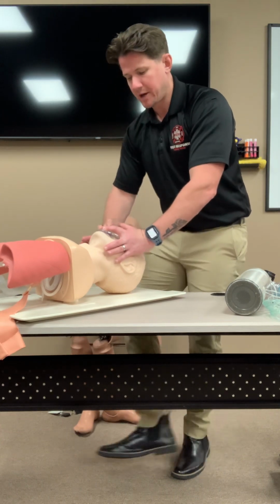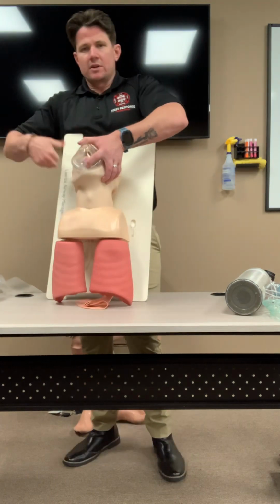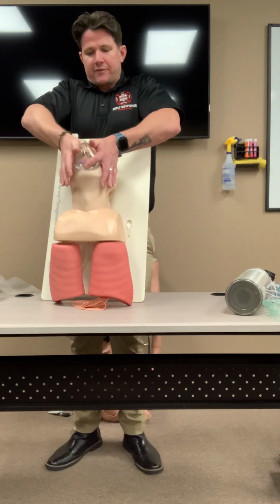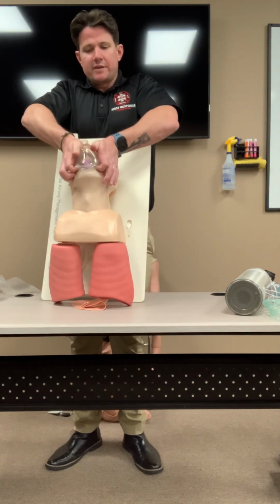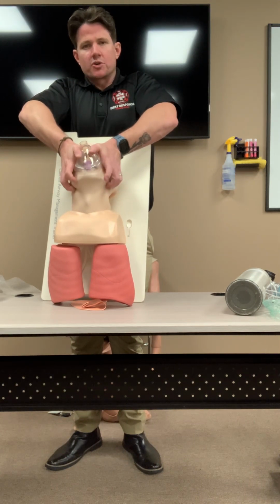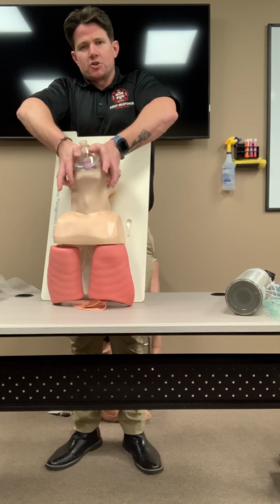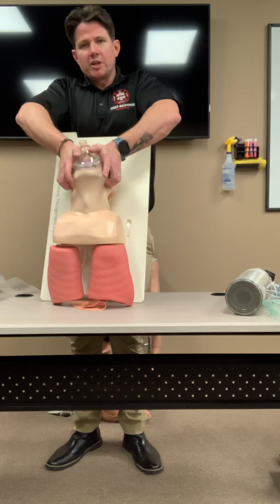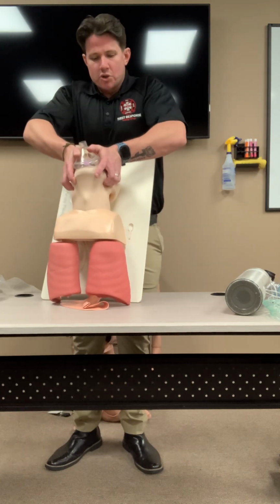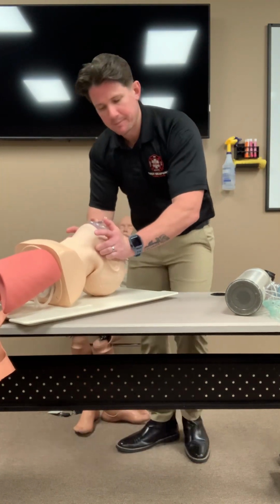But what I like even better is the 2 thumbs down technique. And what that looks like is after you pull your fingers out of the mask, you just leave your thumbs where they're at, and now you have all 4 fingers to grab this jaw. Now you find the joint of the jaw, and now you can really pull up on this. So you get a better harness and anchoring at the jaw, a better grip. That's number 1.